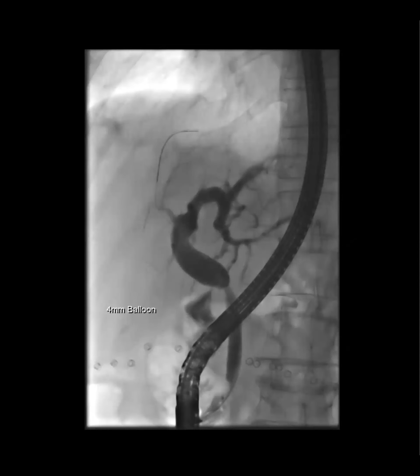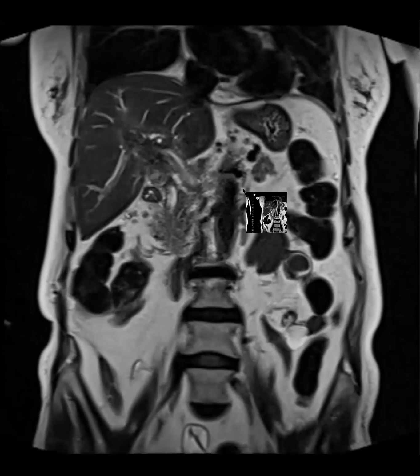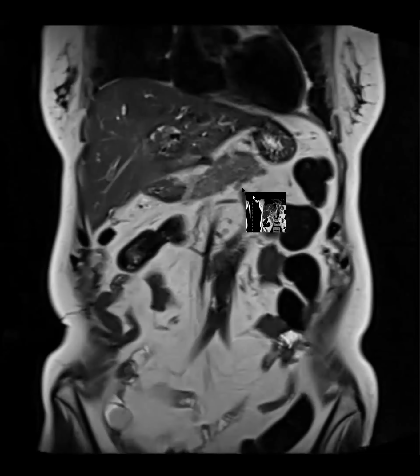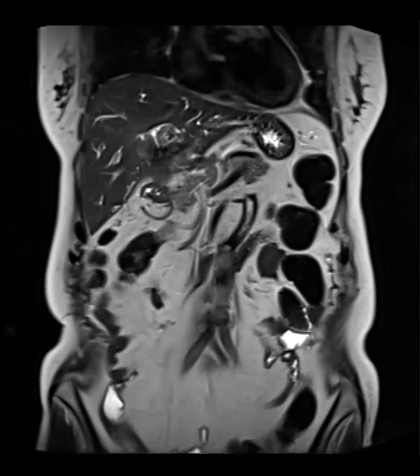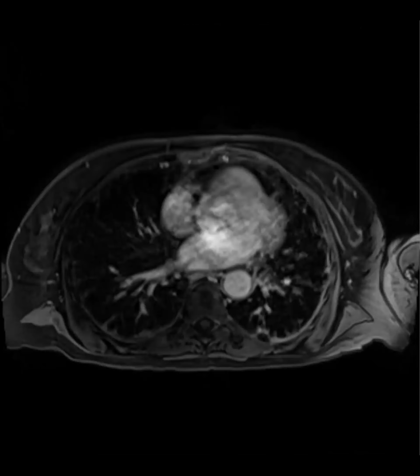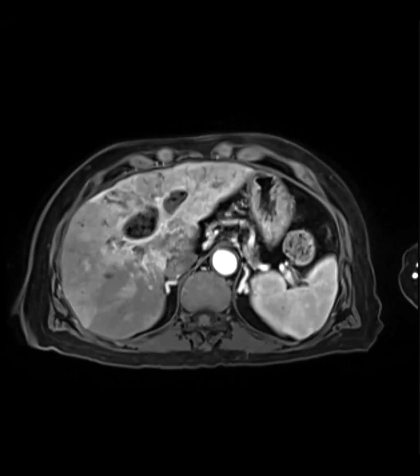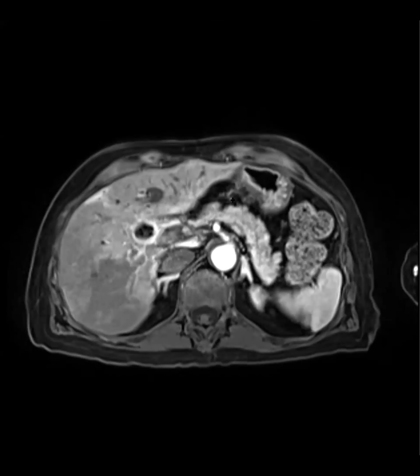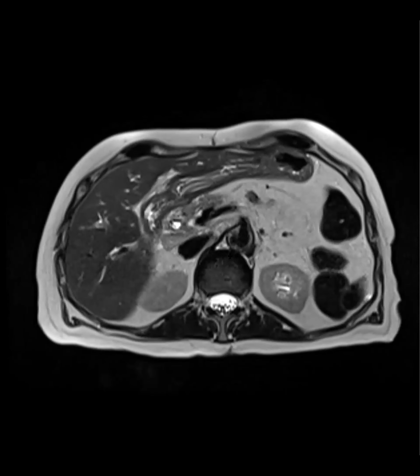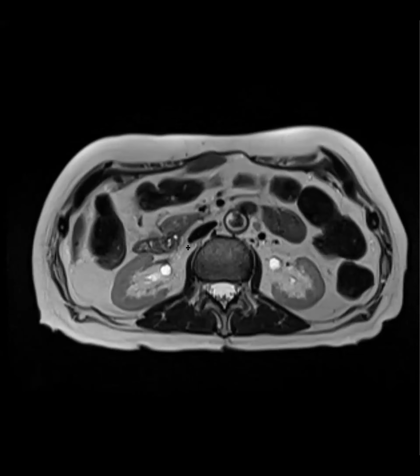And then the patient had a follow-up imaging sometime later. And then this is what the follow-up looks like. LFTs nearly resolved. The transaminitis, bilirubin went down. There's still some reactive parenchymal changes on the contrast enhanced imaging, but it was sort of trending the right way. And that edema resolved, but there's still pretty extensive non-enhancement, hypoenhancement of that area along the biliary ducts. There's a stent in place with extensive pneumobilia right now, and the LFTs improved significantly.